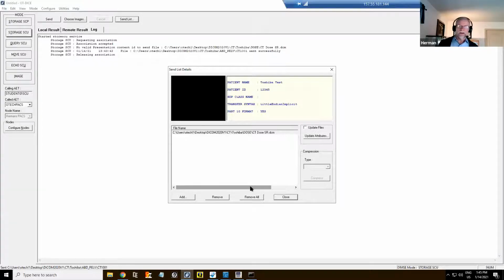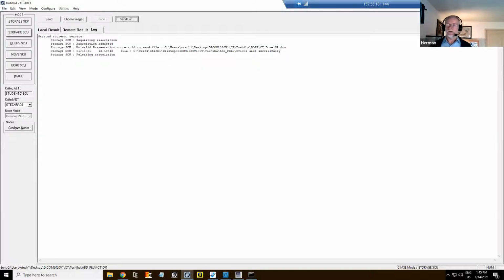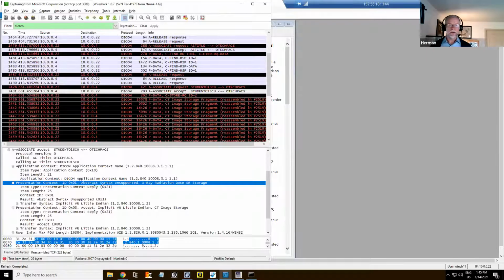And again, at your modality level, there might be something like a DICOM error. Now we can see exactly what's going on. Oh, this technologist is trying to send a dose report to the PACS, and those reports are not supported by the PACS, or maybe it has to be sent to your dose management system, or maybe the dose report has to be sent not as a dose report but as a DICOM structured report. Maybe we need to do it as a screen capture at the end, whatever. After we find out what the problem is, we can start figuring out how to solve it. But if you don't find out what the problem is, you have a problem.